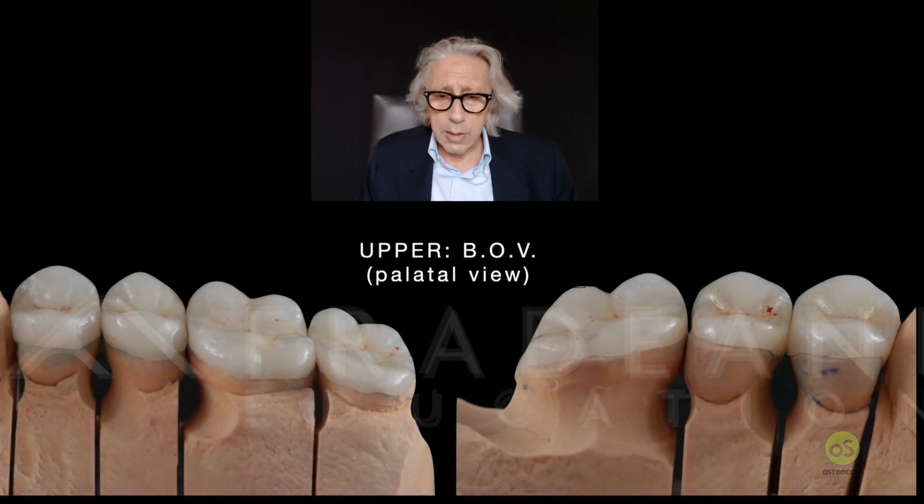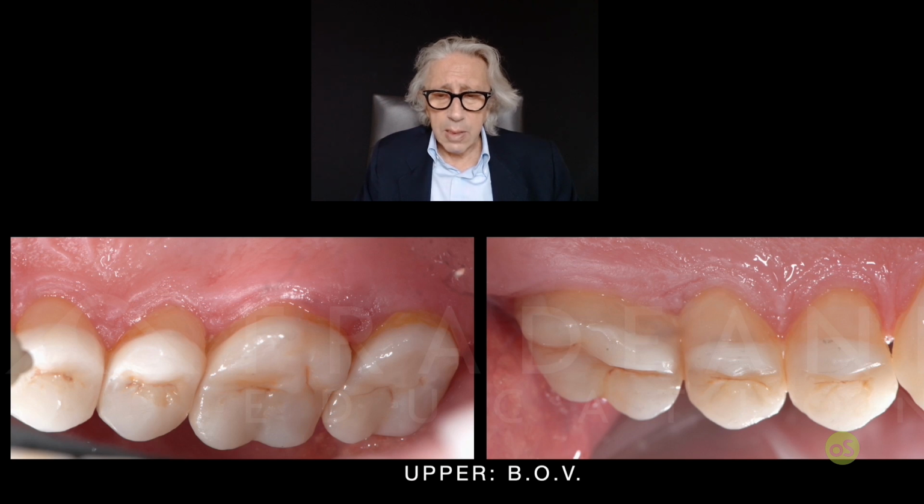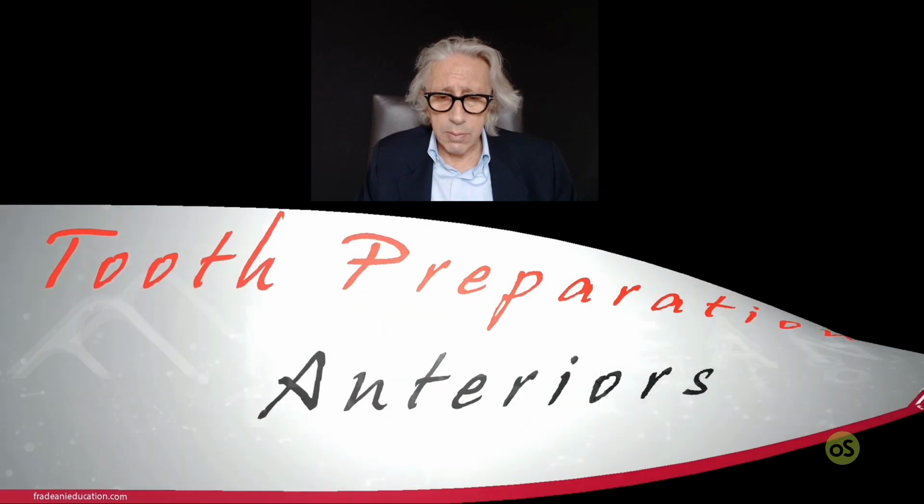Lower, sorry, there is a kind of mistake over here. It is the palatal view, yes, sorry, palatal view. In terms of finalizing with the bonding procedure, all the upper buccal occlusal veneers.